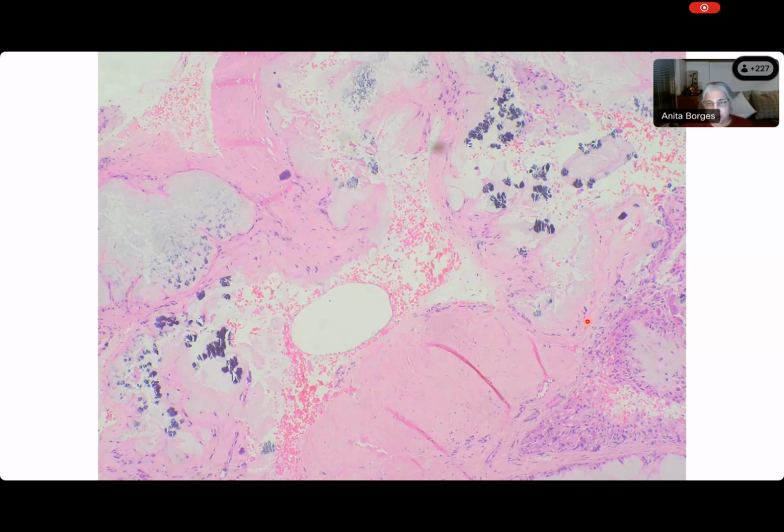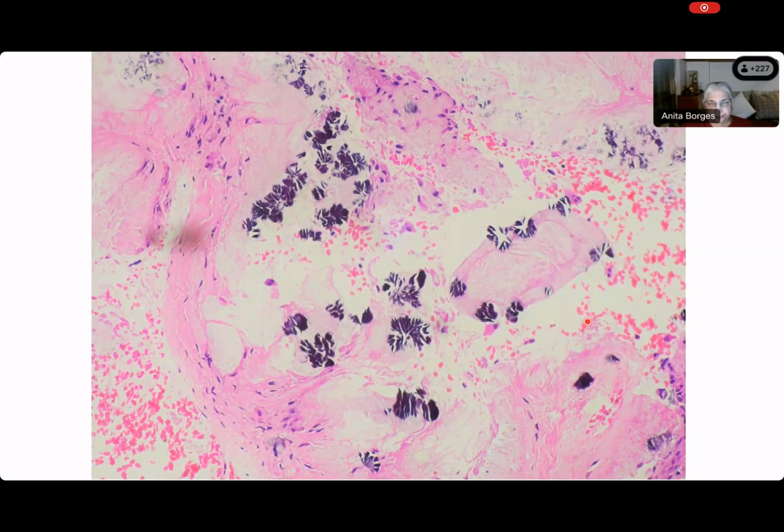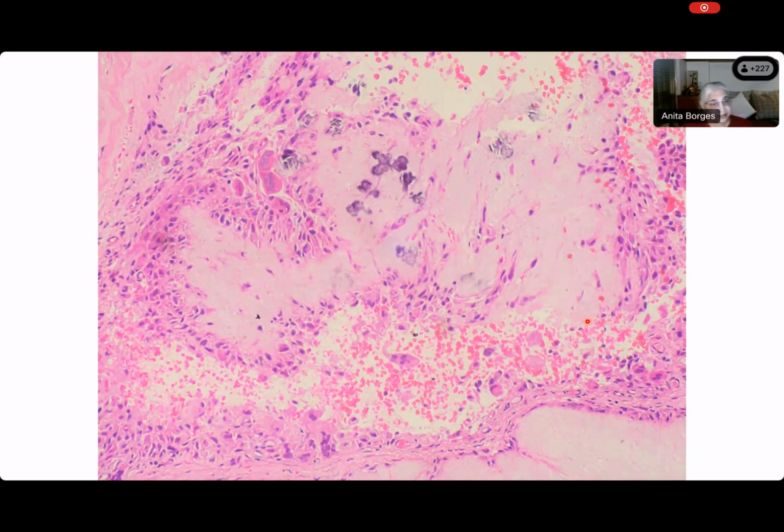Come on, Mansi, that's not difficult. What will those other cells be? Here you are, you're seeing them at high power. And you can see the foreign body giant cells. Yes, and you see these cells. So what cells do you think they are? Now, I hope you're describing them in your head. Can you describe them loudly for all of us to hear?